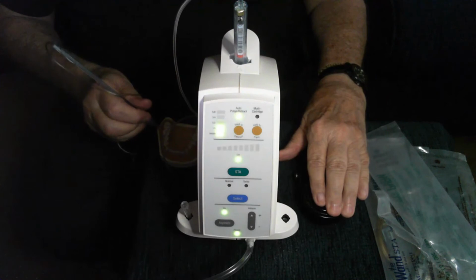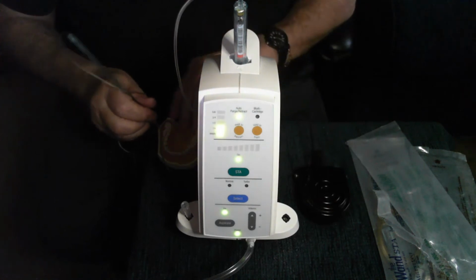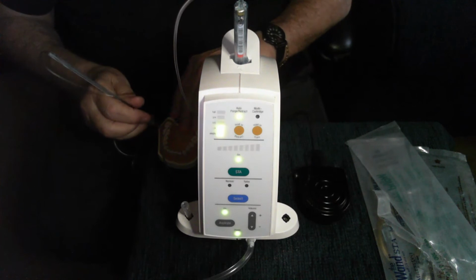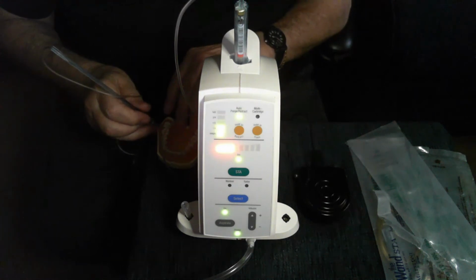The lights will go from red to yellow to green. Sometimes it works. There they come on. If you see the lights come on and you hear the sound and the lights are at red or yellow, that's perfect. Hold the needle in place without putting any pressure on the needle.